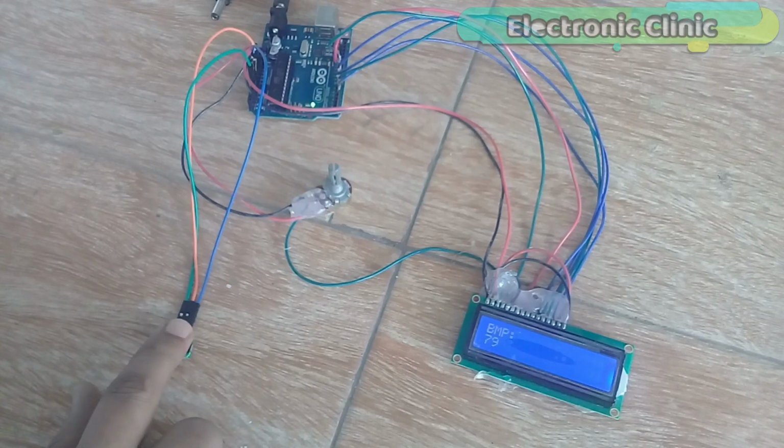In today's episode, you'll learn how to monitor the heartbeat rate or heartbeats per minute using the pulse sensor, Arduino and a 16x2 LCD. In this video, I will explain how to get the stable BPM values. You can see a change in the values as I start breathing fast and slow.